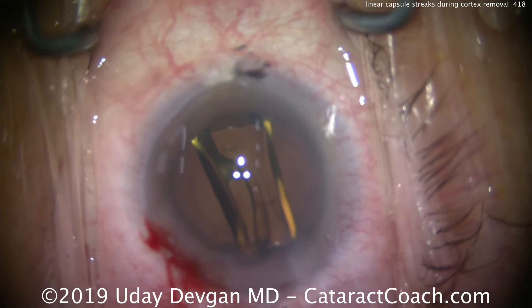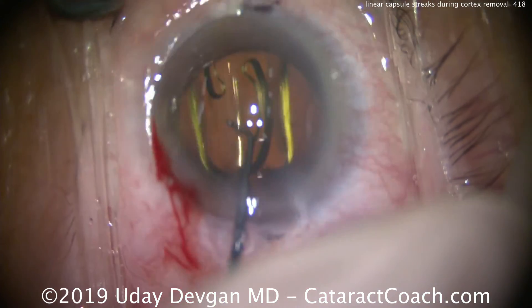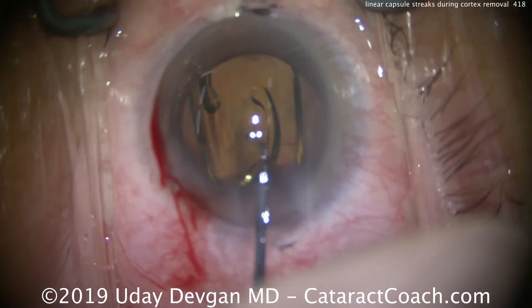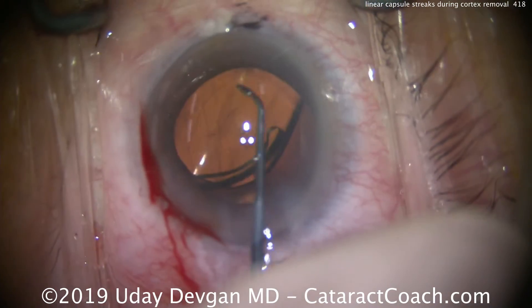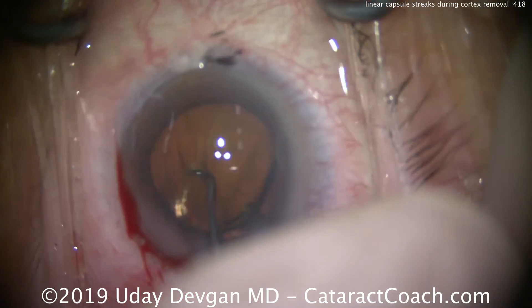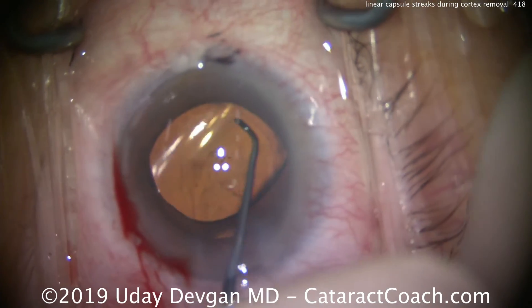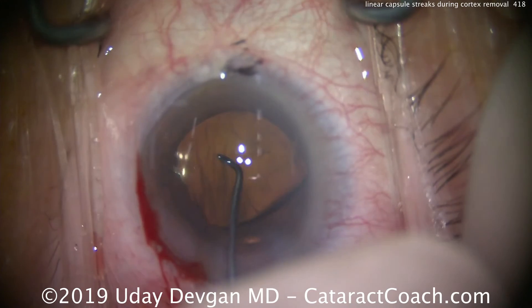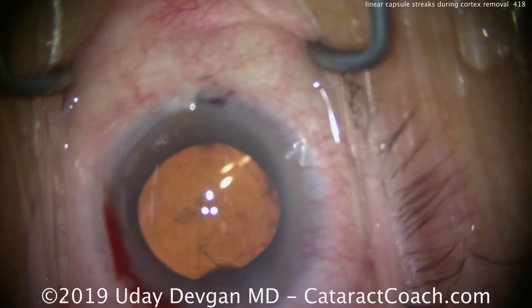We do have other videos here on Cataract Coach explaining how cataract surgery in elderly patients is different. If you're a nonagenarian — 90-plus years old — tissues are different and we have to be a lot more careful. In this case, it was just linear streaks that were residual sticky cortex, ending up being stringy, but the capsule itself is intact and all those zonular attachments are good too.